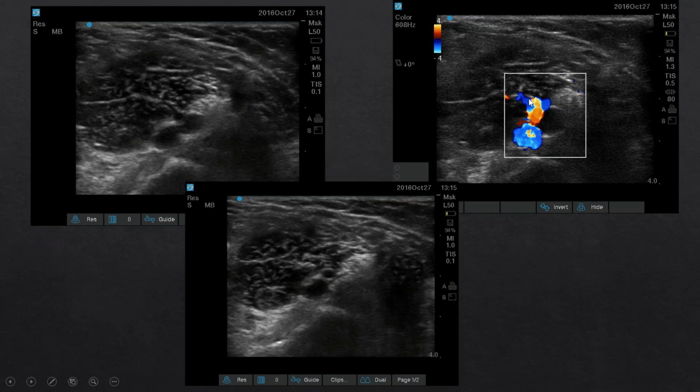Now what you do after that, you will trace it proximal and distal. If it's a vein, it will stay the same caliber, proximal to distal, and then you will move long axis on it, and it should appear like a tubular structure and not a round mass in the second view.